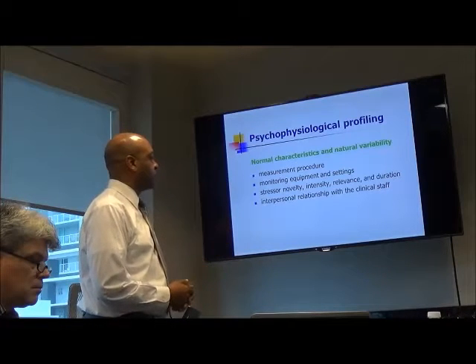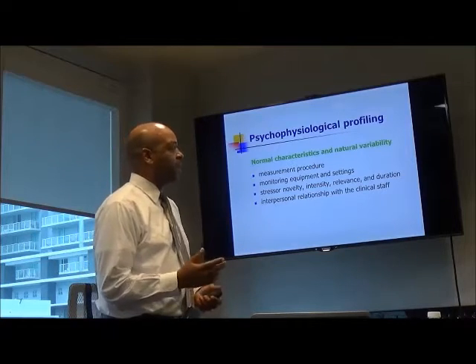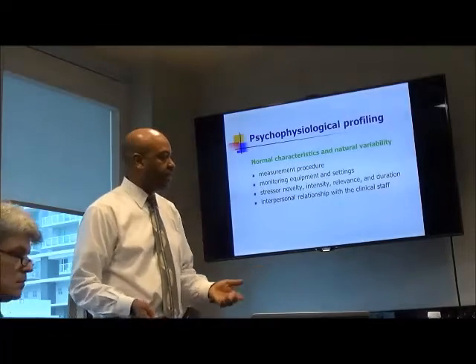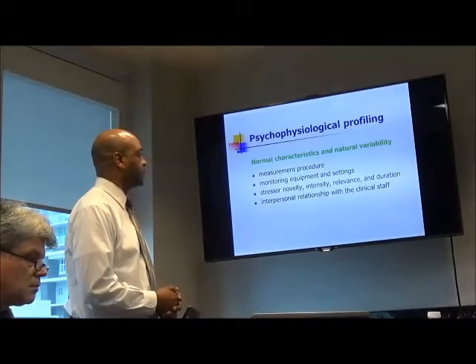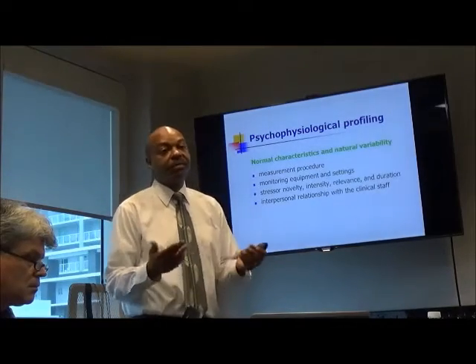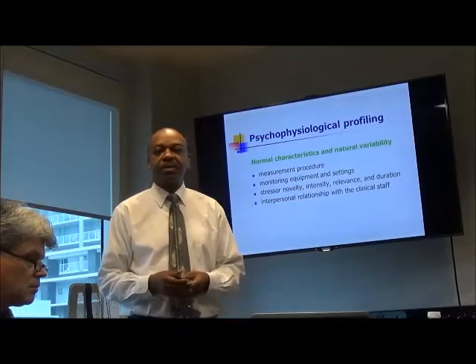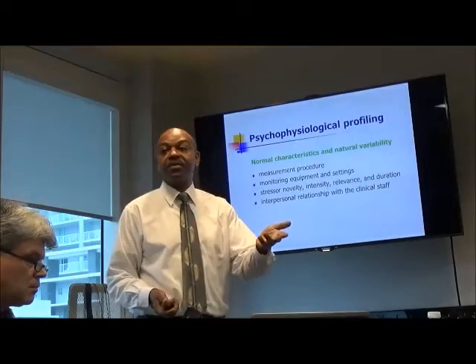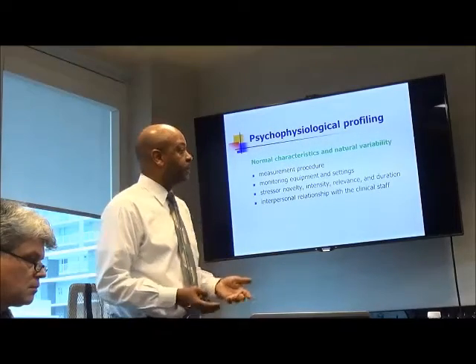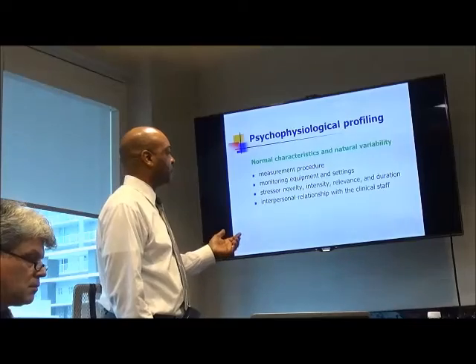Your procedures, the equipment, the novelty of the stressor. So if you've used the same stressor over and over with a person, after a while it's not going to have the same effect anymore. And the type of stressor that you use can be very important. For one person, math may not have that much effect on them, and for that same person, talking about a real stressful event that happened may be much more meaningful to them and cause them more reaction.